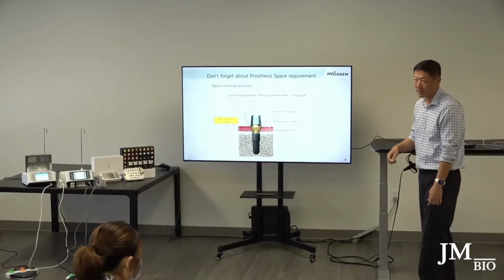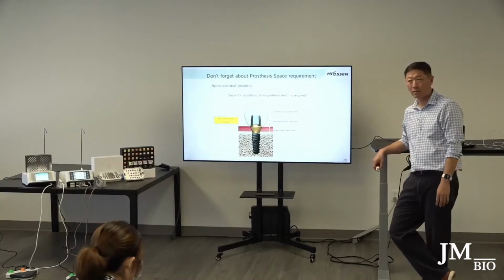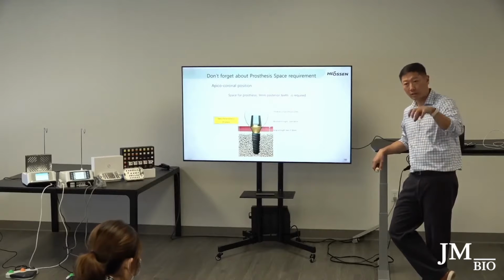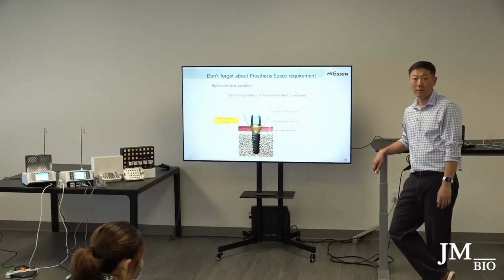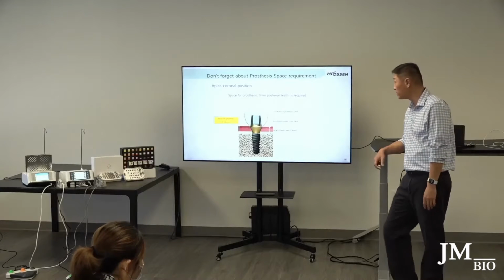So in the back, like number 18 or 31 site, I was talking about one case a couple days ago where I was worried about the occlusal clearance. So I said, use a UCLA abutment, use a gold crown. One piece, screw-retained gold crown. It's all one piece, so you don't have to worry about anything fracturing or coming out. So sometimes it's called for. Even though aesthetically it's not the best looking thing, it'll function and it'll last for a long time.